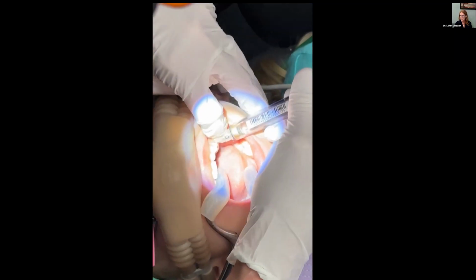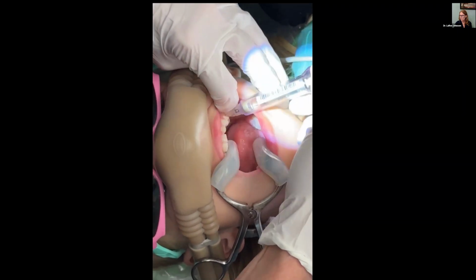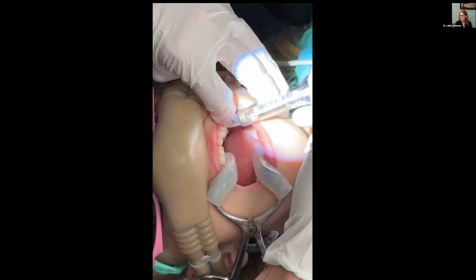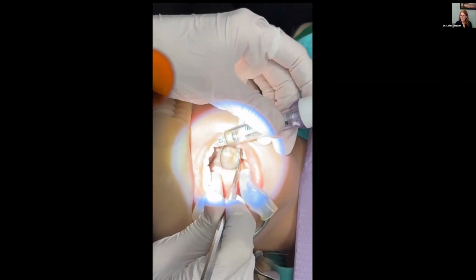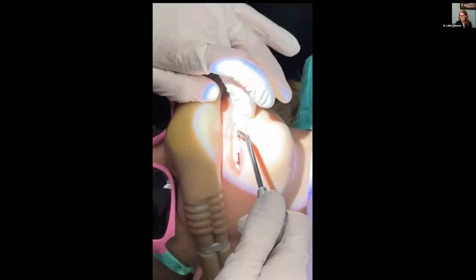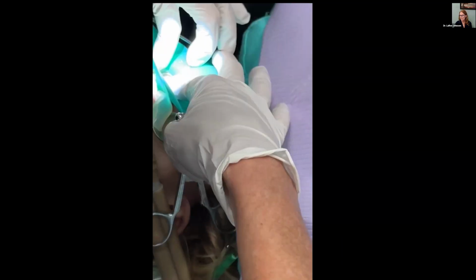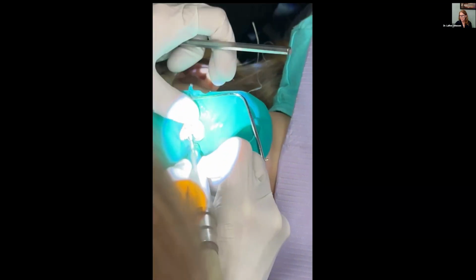I hold it with my left hand because I feel very secure about what's going on, and I'm looking for blanching. Especially if you have a friend, and you can see her eyes, she doesn't care. She came in fussy and everything's good, but I'm looking for that blanching to show my diffusion. Get her a little sip of water, she's doing great. We're gonna put that raincoat on and pick up the handpiece and get to work.